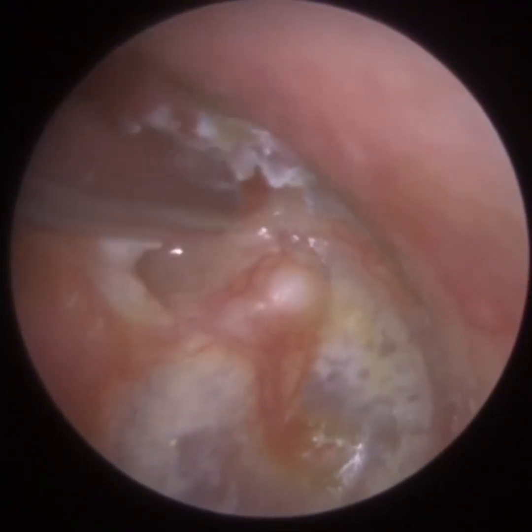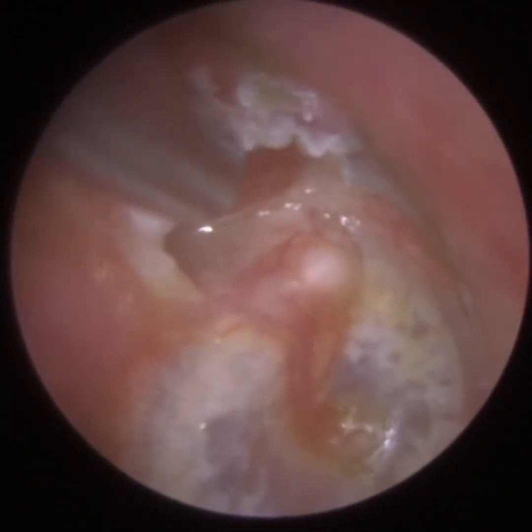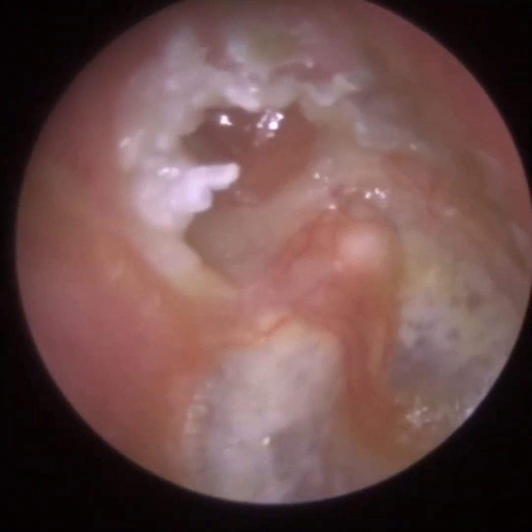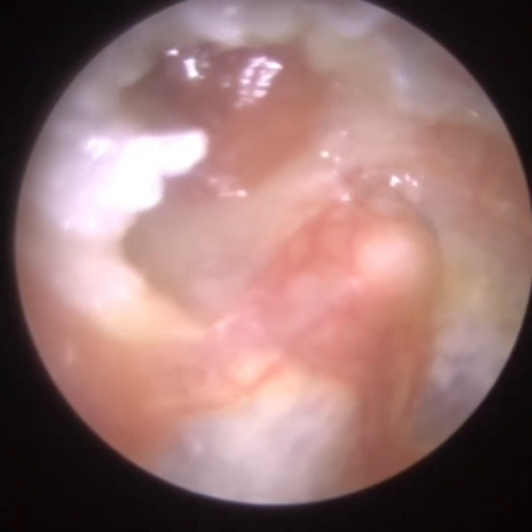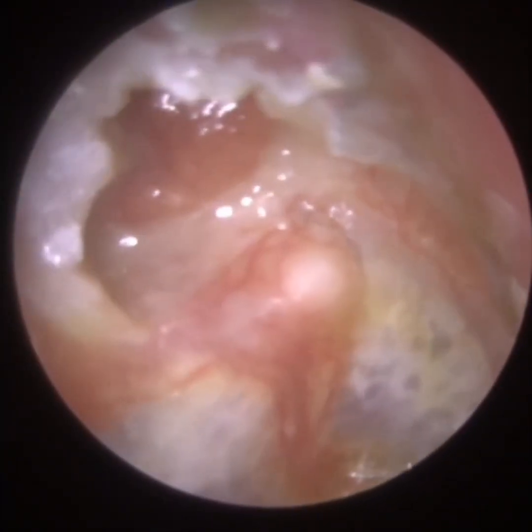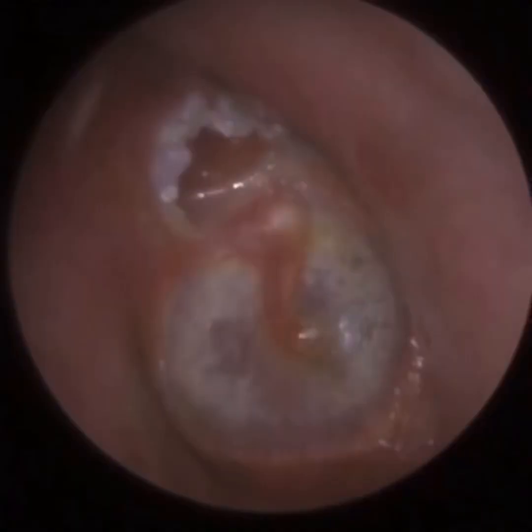I'm just trying to get as much dead skin as I can — I can't get too much, and you can see I've bent the fine-gauge end here, as this skin was quite tough. The main objective was to see where this discharge was coming from — it was coming from this cholesteatoma, dropping to the base of the eardrum in the inferior recess, the annulus. Because it was infected, it was eroding the base of the ear canal near the eardrum, causing widening, and the discharge was then trickling out of the ear canal.